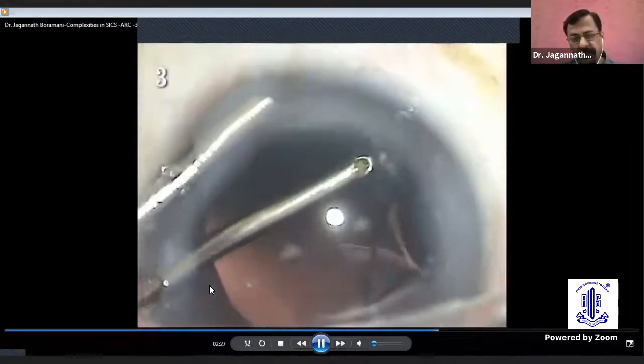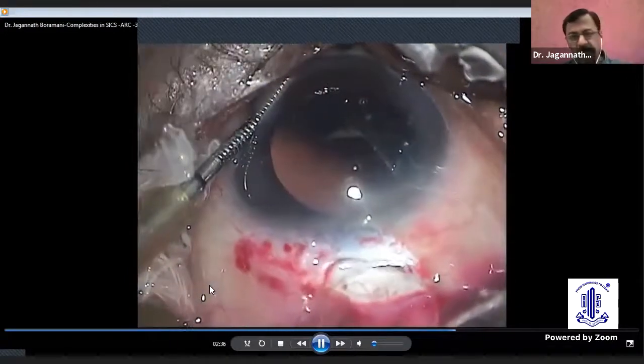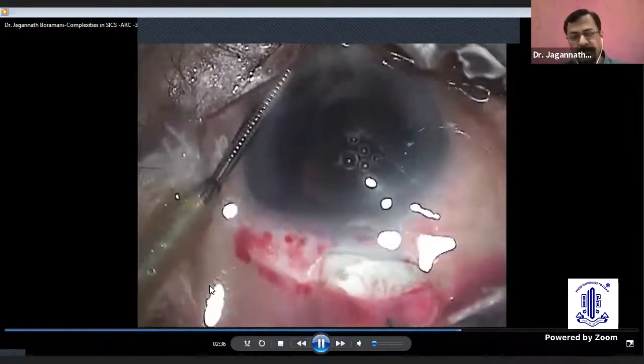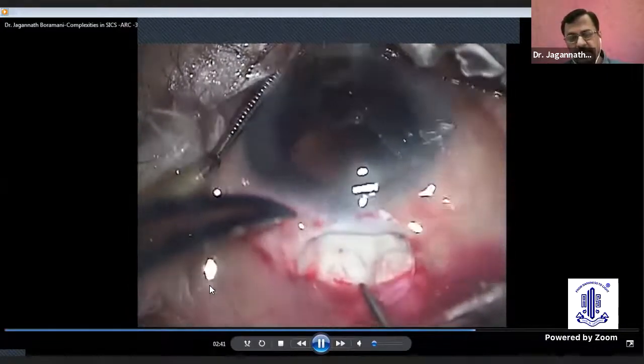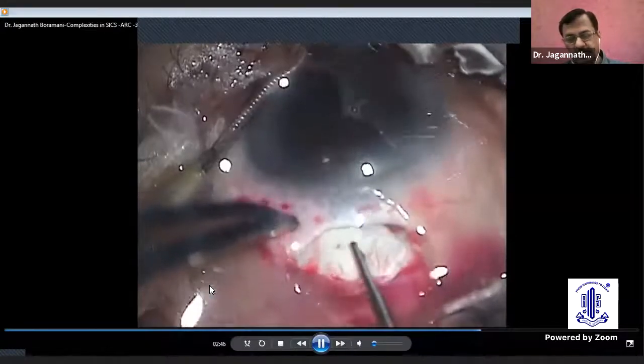Now I will highlight a few uses of the AC maintainer. In this case, the PC has torn, but still there is no vitreous prolapse, and AC maintainer can act as a savior. It saves you because it maintains the pressure in the chamber, and you can complete the maneuvering with gentle maneuvers. You can complete the procedure.